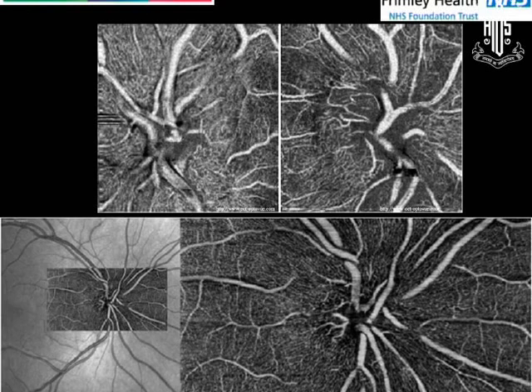And they started off with optic disc imaging, and then found that you can actually do very good imaging of the macula as well. So this is a big leap in the advent of retinal imaging.